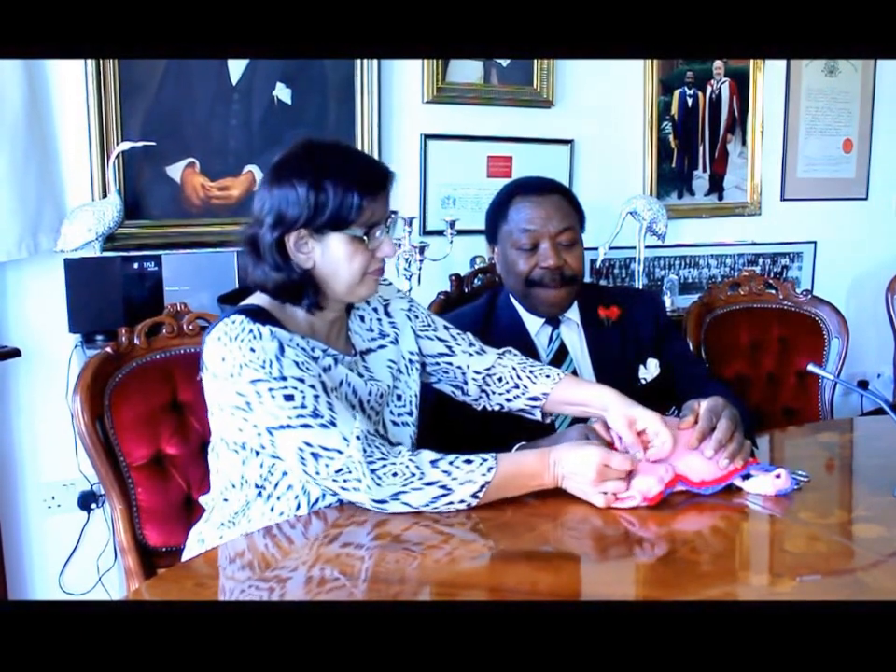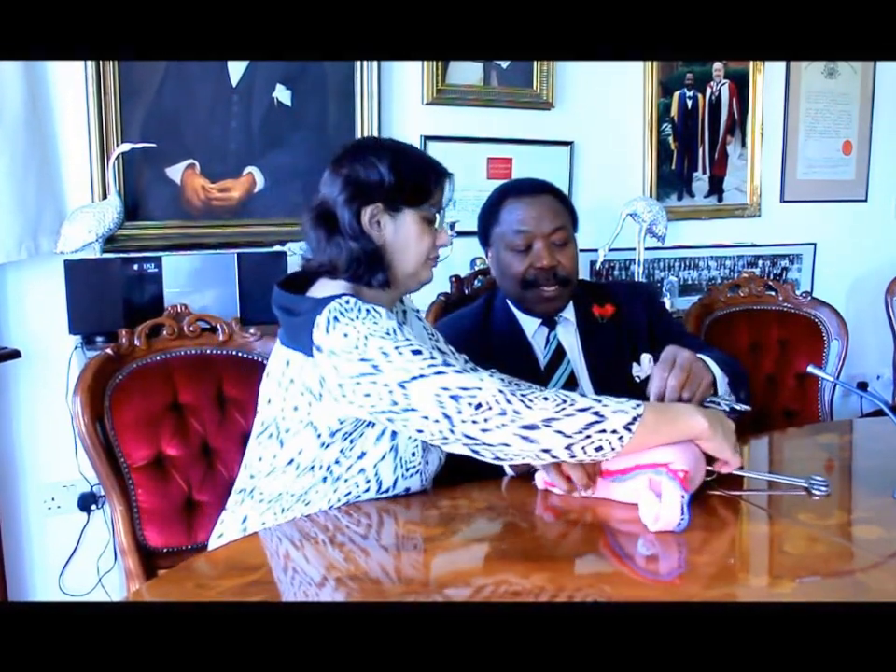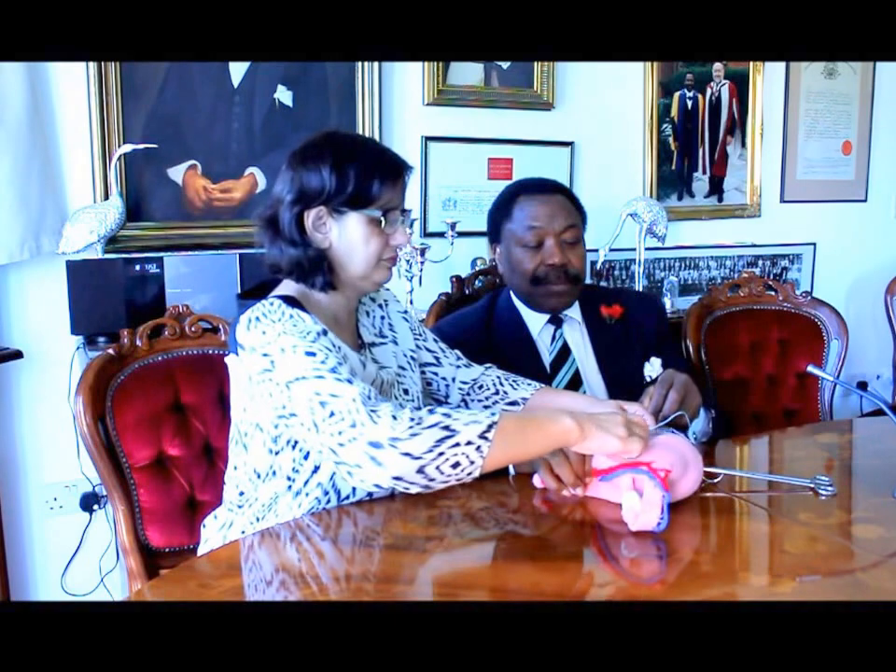You will now close the incision on the vascular pedicle on each side by a one or two layer technique as preferred. Once that is done, the bimanual compression is again established while the suture is tied using the double-lock technique.